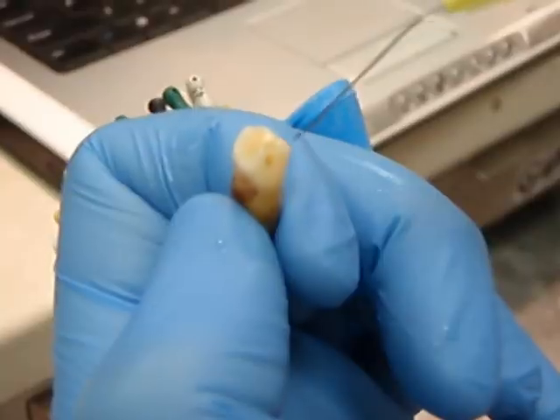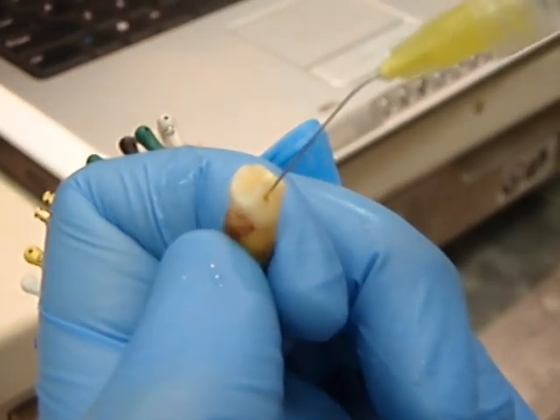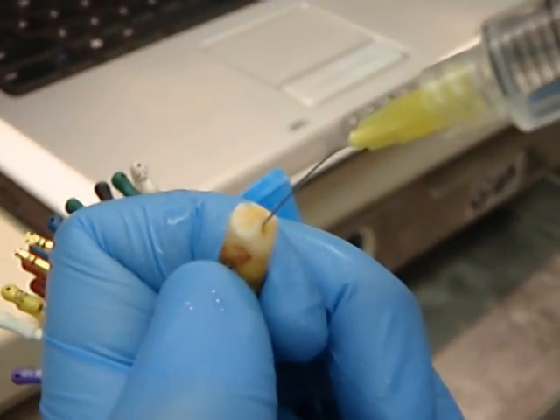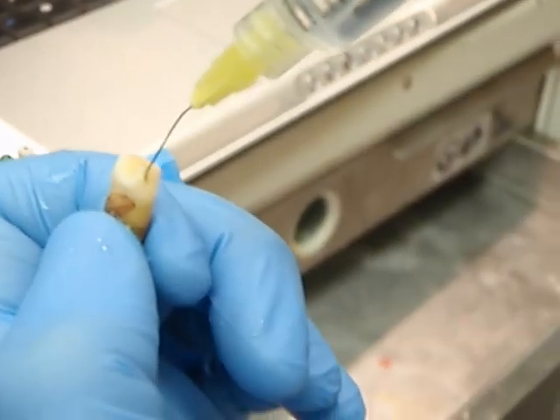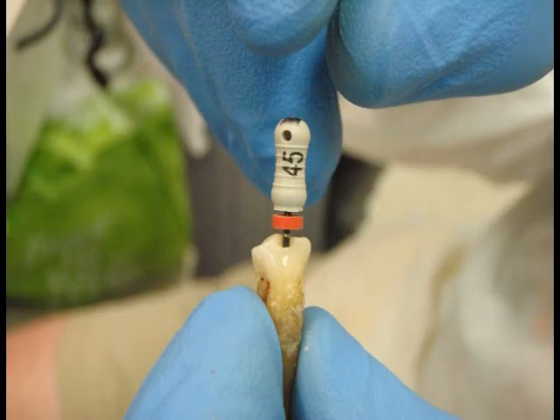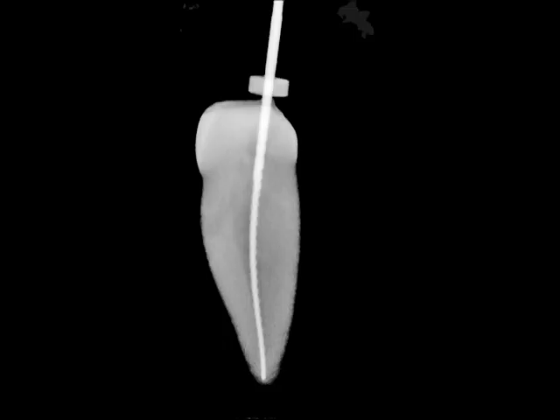Remember to continuously flush debris from the tooth. Take radiographs of the master apical file at working length and measure to confirm.